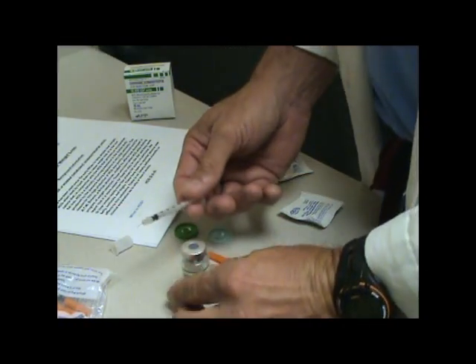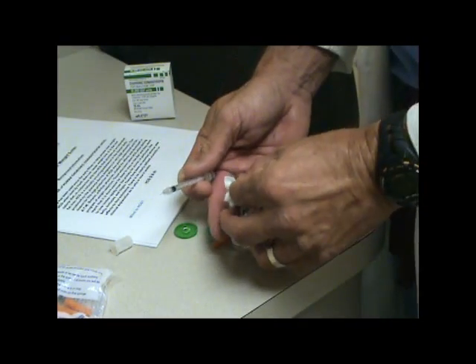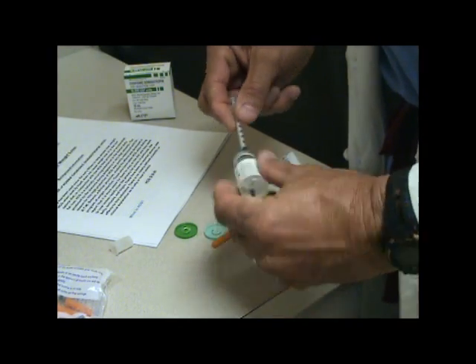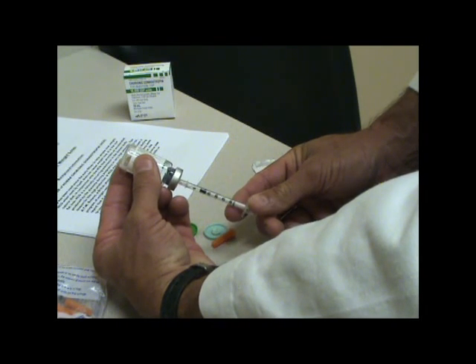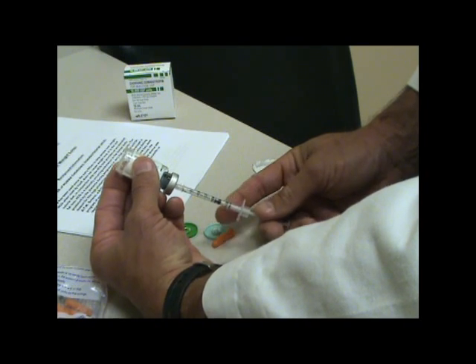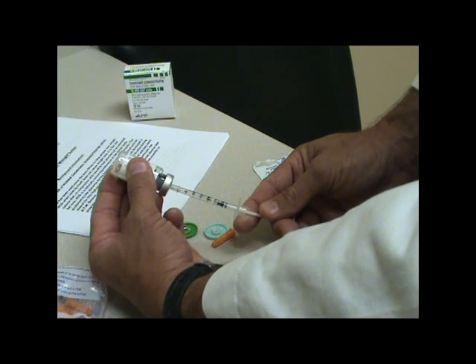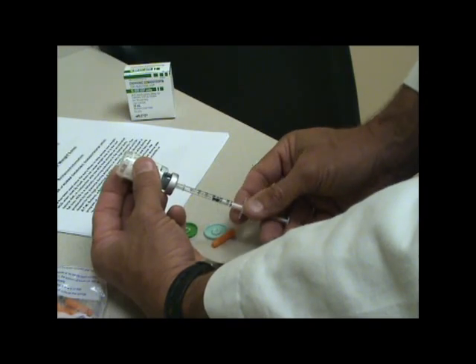Since this has just come out of the refrigerator, it's a good idea to wipe it down with alcohol or a piece of tissue soaked in alcohol. Go right in the center — try to stay right in the center — and pull back. You're going to go initially to the 20 mark. For the second phase, you'll go to the 30 mark. So right now, just starting the therapy, you're going to go only to the 20 mark.